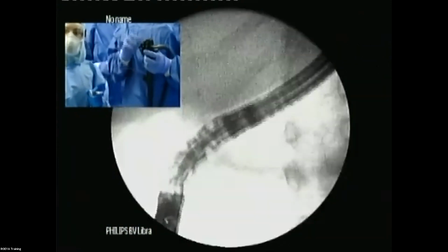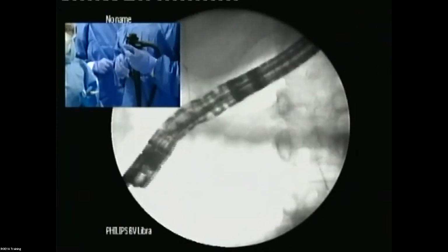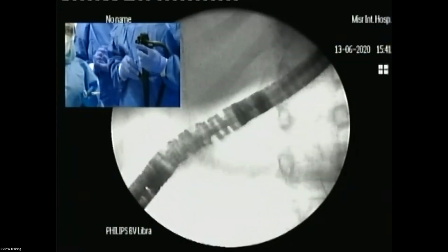When I work with the stent, I first prefer to pull the lasso very close, almost completely inside. Hani, your voice is not so good.